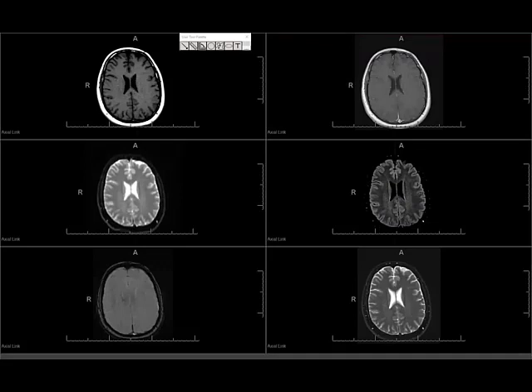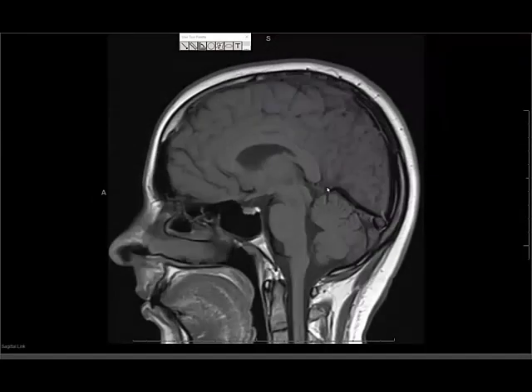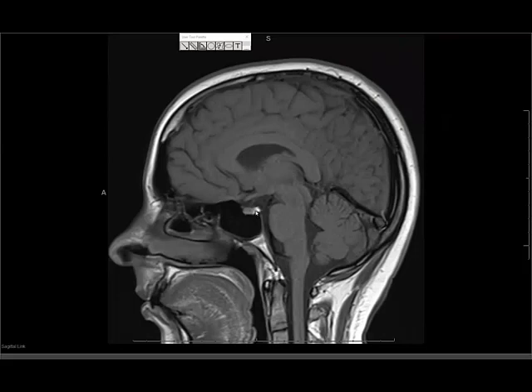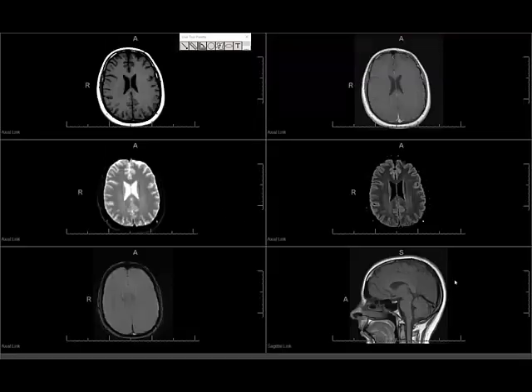After this, I look at the sagittal T1, which is very good for midline structures. I stop for a few seconds right in the middle of the image and look at the sella, the stalk, the posterior pituitary, the anterior pituitary, the bone marrow, the clivus, the upper C-spine, the tonsils to make sure they're in the right position, and the corpus callosum. I also try to see the cerebral aqueduct and look at the pineal region to make sure nothing is going on there.